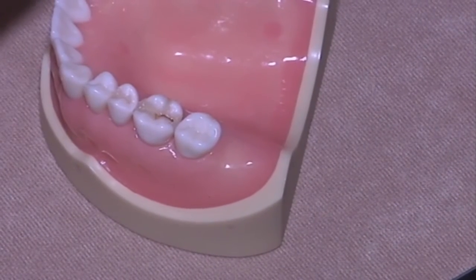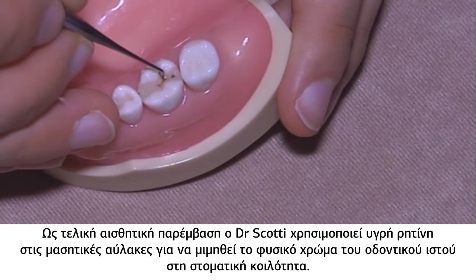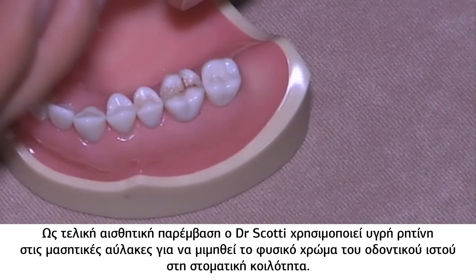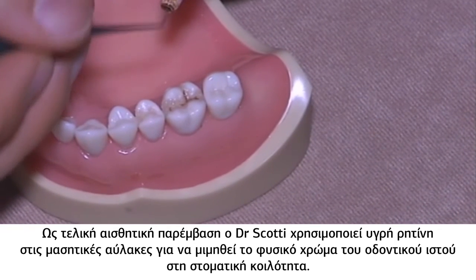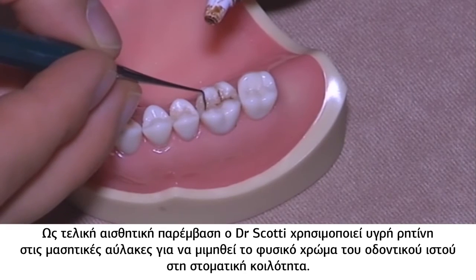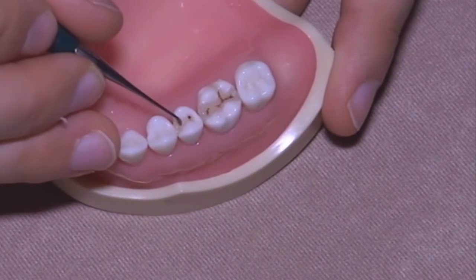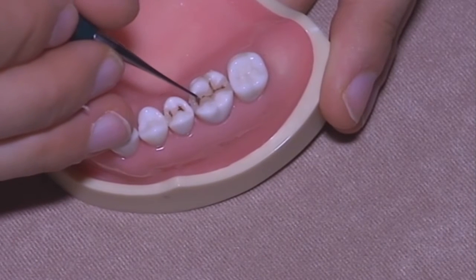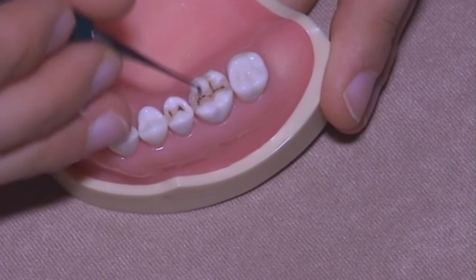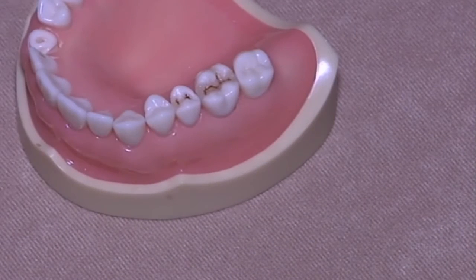So you just place a little drops inside, and then you remove the excess with a brush.